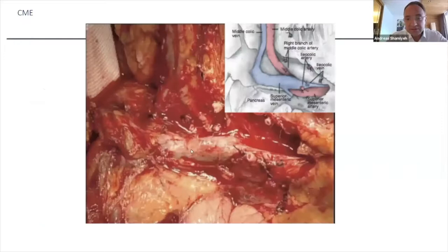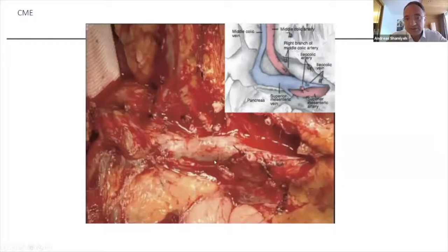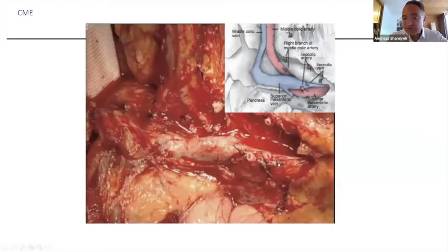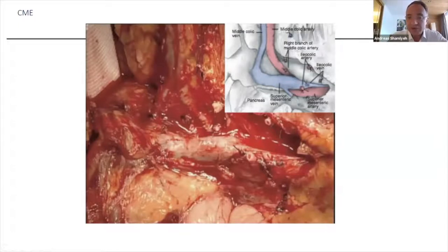Here you can see the superior mesenteric vein — this is the crucial point. You go up, here's the pancreas, and you go to the origin of the superior mesenteric vein and artery. Like on the left side where you start at the ligament of Treitz, you have to free all the surrounding area from the lymph nodes.